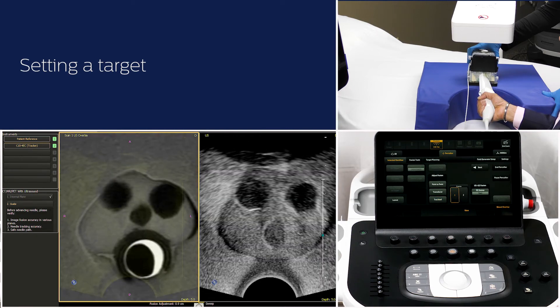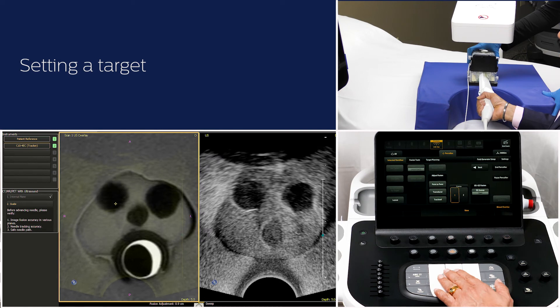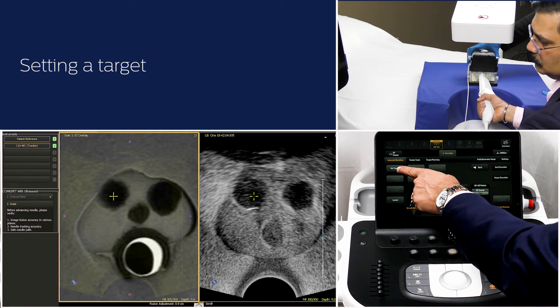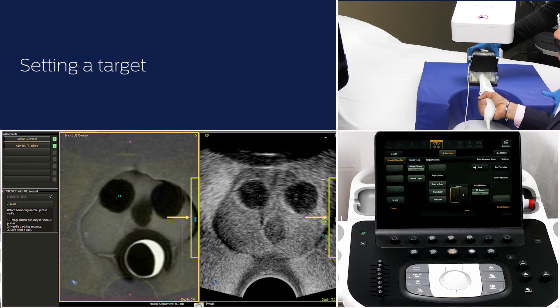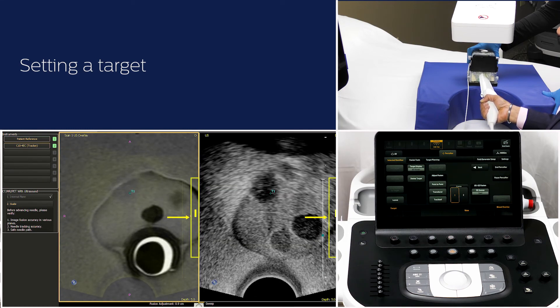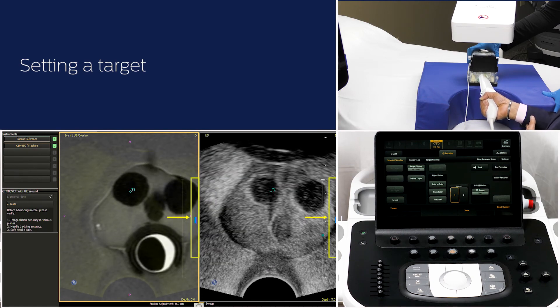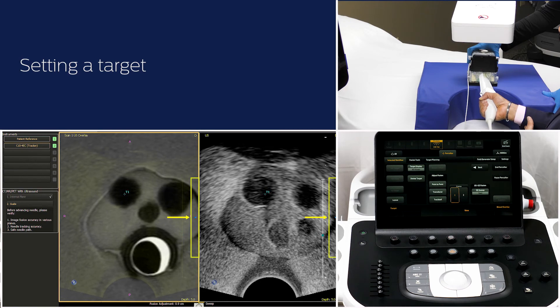You can set the target in the MR image where the suspected lesion is most probably seen. Once you set the target, the ultrasound guidance bar will appear on the screen. If the guidance bar is yellow or blue, that indicates the target is out of scan plane. No bar indicates that the ultrasound image and target are in the same plane.